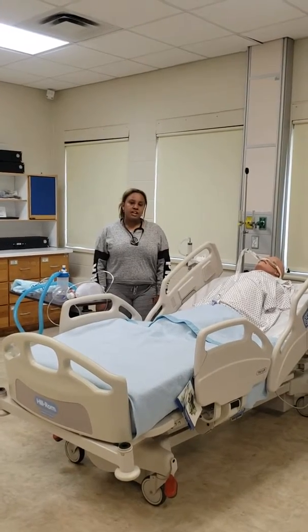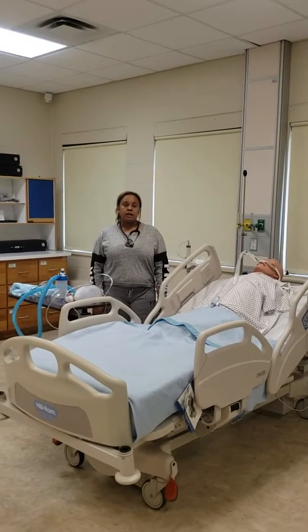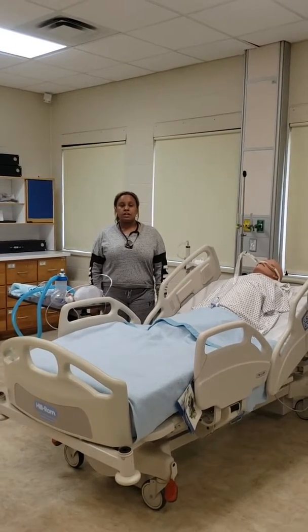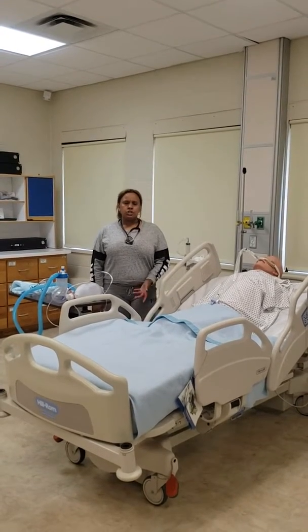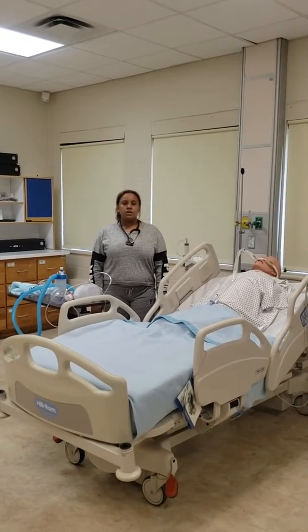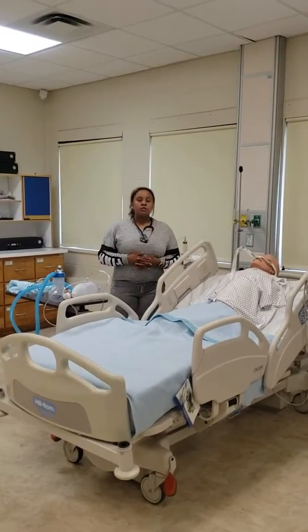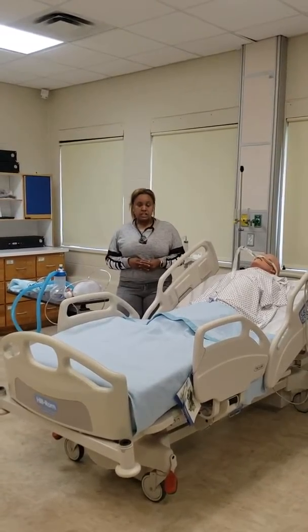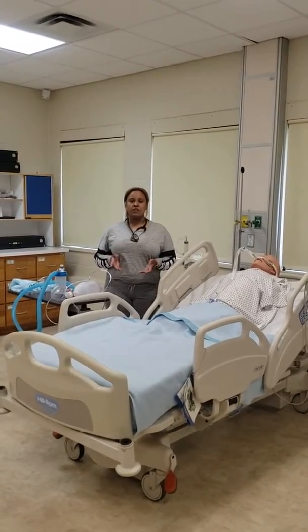Hi, today I will be demonstrating extubation. I will verify the physician's order and evaluate indications for the patient assessment, which includes the reversal of the underlying indication for intubation. I review the patient's chart for any significant findings, such as arterial blood gas, the last time they had that done, and the last time they had vital pressures.